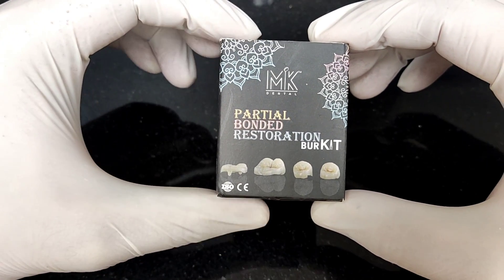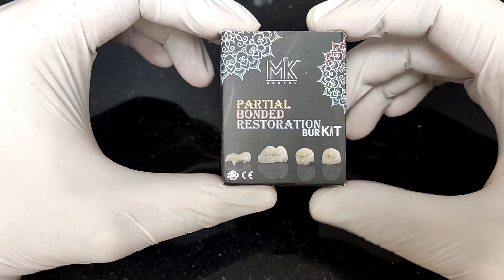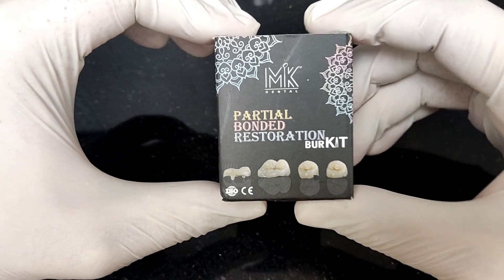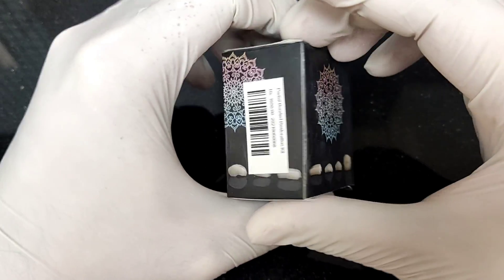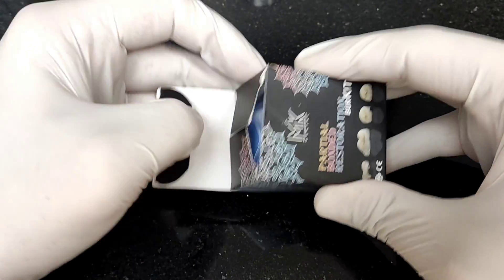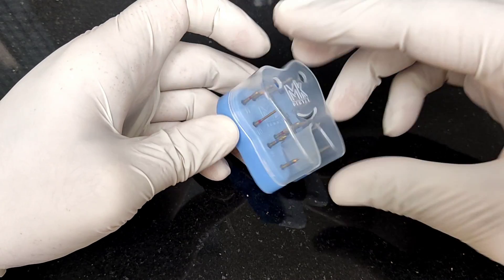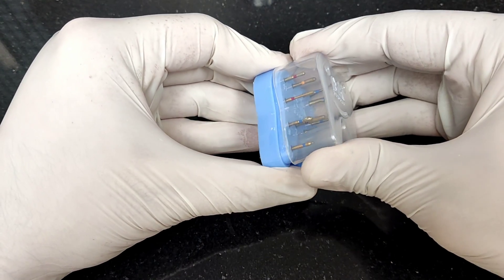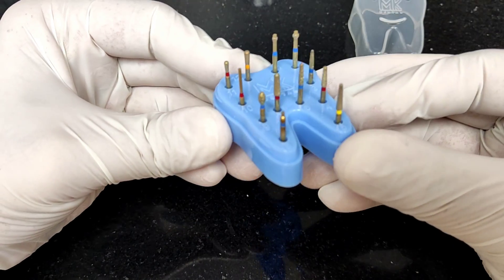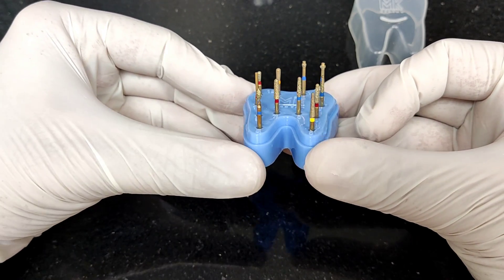This is the burr kit personally designed for fabrication of tabletop restorations, called the Partial Bonded Restoration burr kit. It looks really classy, but more important than the external box is what lies within. Inside is a tooth-shaped, tooth-colored, blue autoclavable box containing 12 different burrs with different grits and shapes.